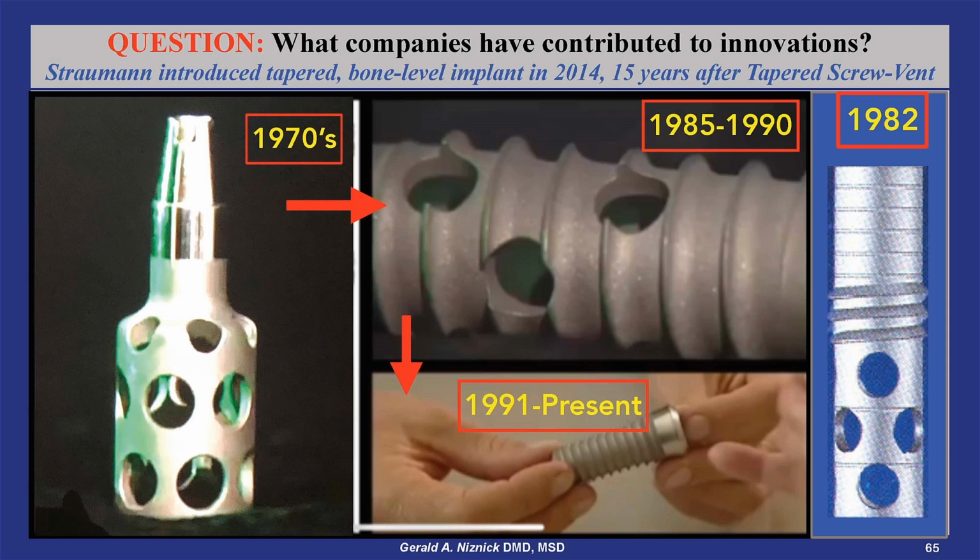Corvent patent. After a court battle, they had to take it off the market for 6 months until we reached a licensing agreement. In 1990, Straumann switched to this straight cylinder screw that proved that a one-stage surgical protocol was as successful as burying the implant during the healing process. It took Straumann until 2007 before it introduced a bone-level implant.